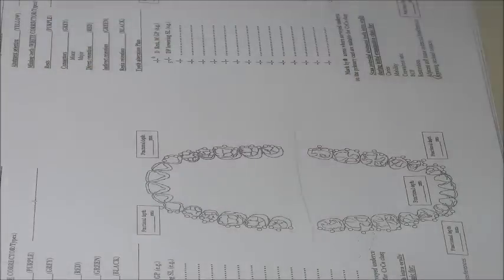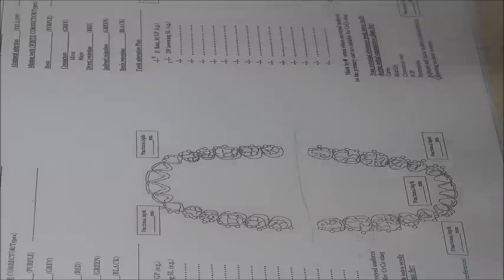Let's go back to the definition. What is the suitable undercut? A suitable undercut is where I want to end my clasp suitably to serve all of the biomechanical principles. Okay? It has relations. Try to imagine it in 3D. It has 6 relations. What is its relation closely with the survey line? It's below the survey line, right? It's in the undercut. Which undercut? The one suitable for the clasp.